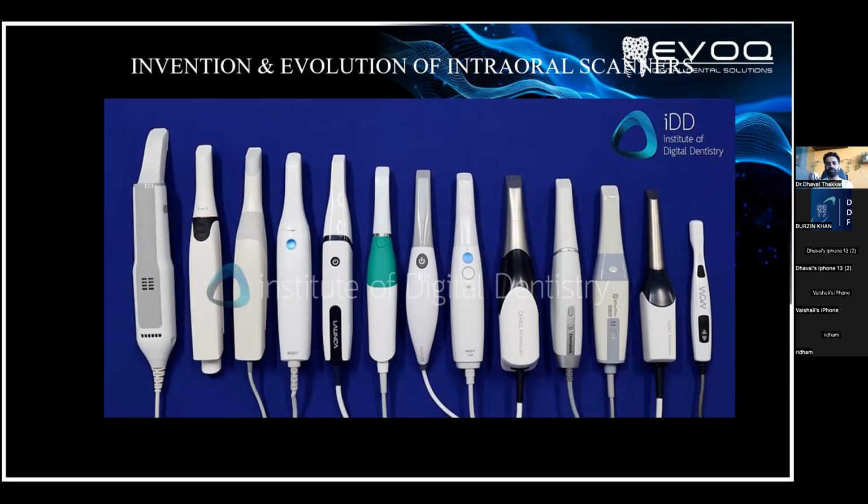And the third thing is the openness of the scan software, whether you will be able to send the open file to any of your labs, or the scanner is a closed system where you cannot send the file across to any other platform or laboratory, and then you are bound to a particular company or laboratory. So the third thing is the most important thing before buying the scanner. You can do n number of cases with n number of opportunities and n number of file exportations. So the main thing in choosing a scanner is the open file system, which includes the STL file, PLY file, and the OBJ file.